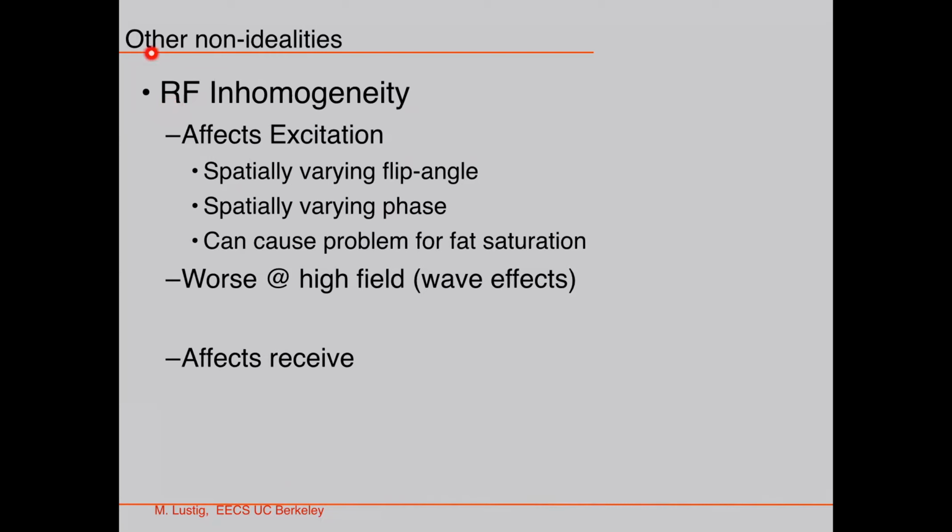Okay, so let's talk about other non-idealities in the next 10 minutes or so. So first of all, we assume that the RF is uniform, right? However, guess what? It isn't necessarily uniform, or perfectly uniform.